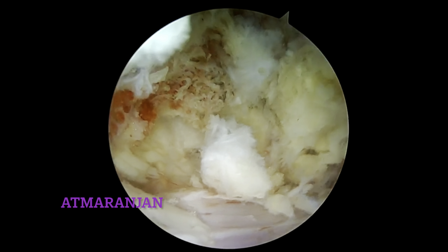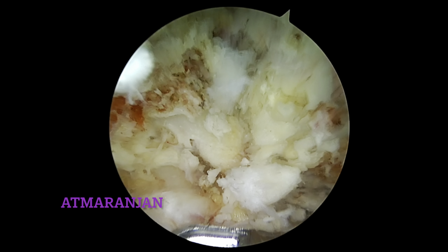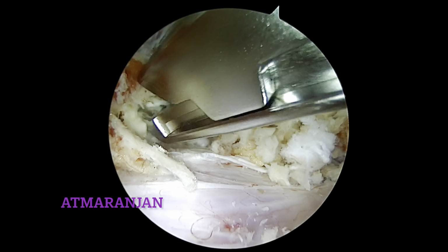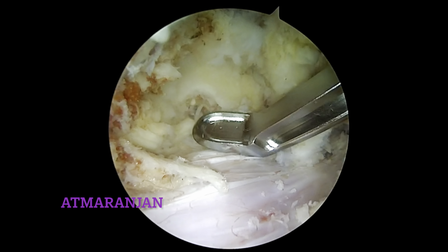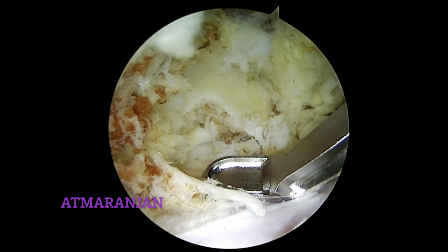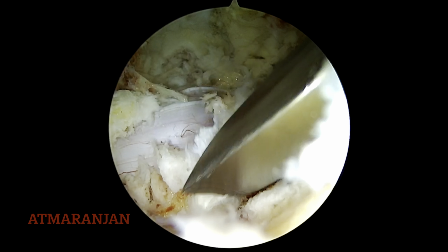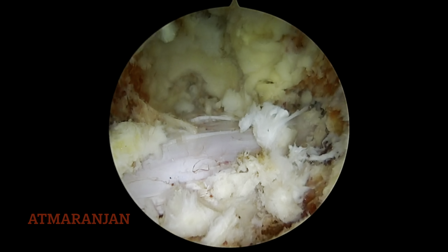You can see a lot of bony work has been done to shape the canal. The contralateral disc and the contralateral tip of the SAP is excised to make the foramen wider, and this can be very well done with unilateral biportal endoscopy because of its versatility of the procedure. There is a lot of bony hypertrophy which is chiseled down to increase the diameter of the canal.